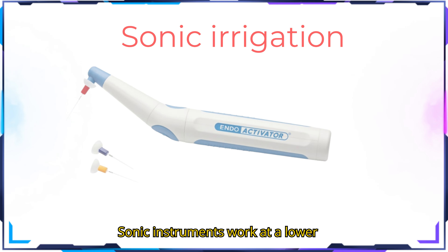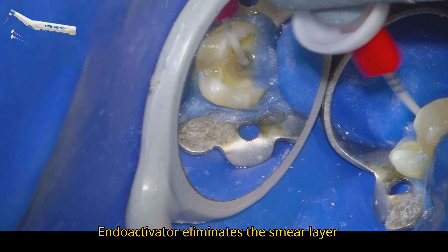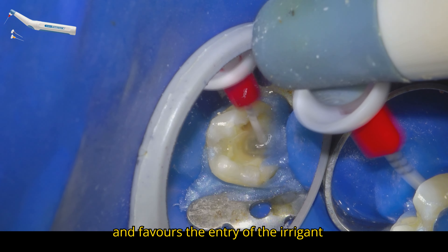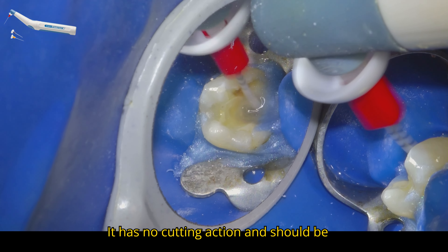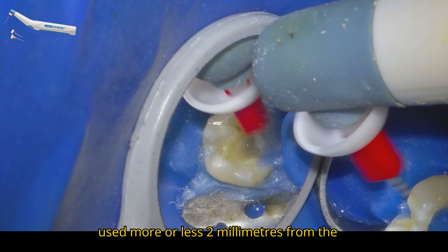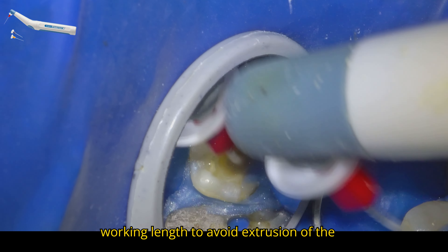Sonic instruments work at a lower frequency than ultrasonic instruments. The endoactivator eliminates the smear layer and favors the entry of the irrigant into the lateral canals. It has no cutting action and should be used approximately 2mm from the working length to avoid extrusion of the irrigant.